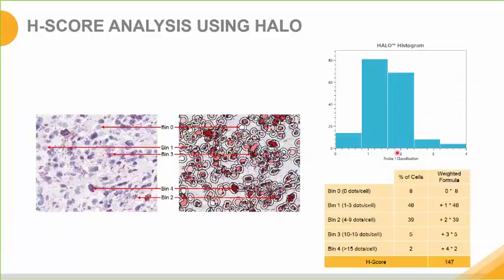In HALO's software, H-scoring is also a feature. This quantitative H-score analysis is highlighted in this slide. In this type of analysis, each cell is assigned to a bin, similar to what I described before, that's based on the number of dots per cell.